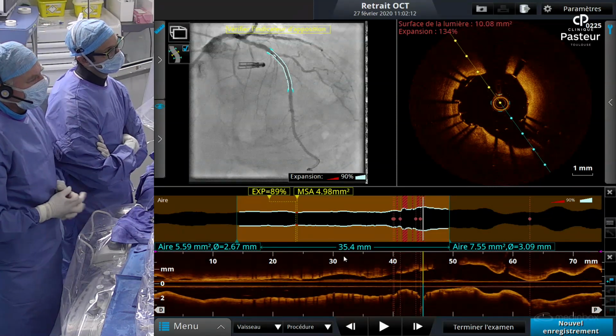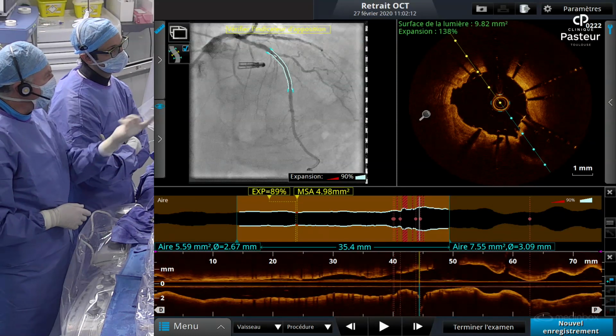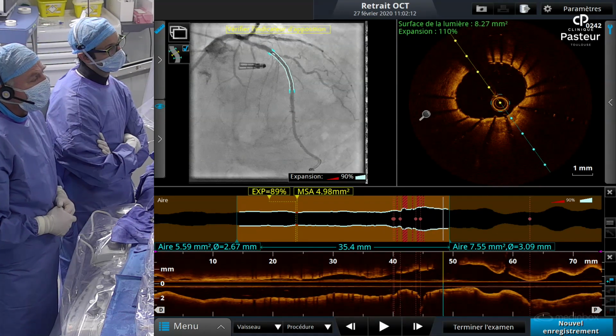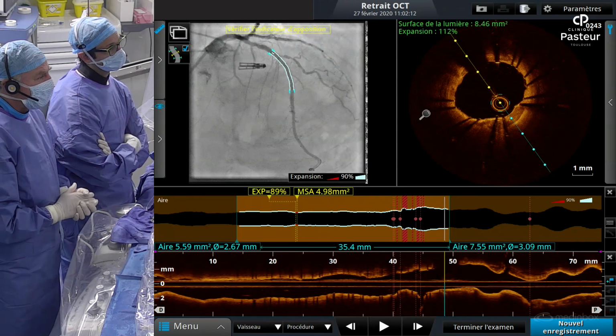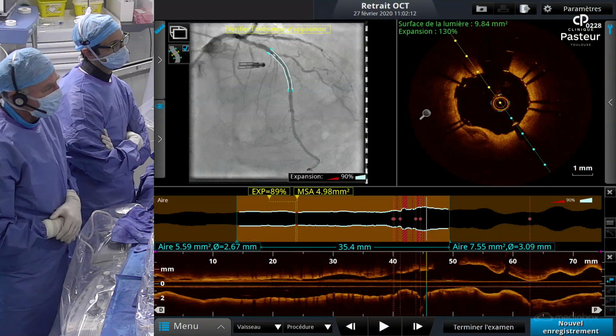I'm not sure that the stent will improve the result. They could improve the ostial lesion that was there before, but the opening of the struts at the level of the ostium is quite nice, huh? Yes. I absolutely agree, and we don't see any proximal dissection also. I think that for me the result is okay. I will accept this OCT evaluation and also this angiographic result.